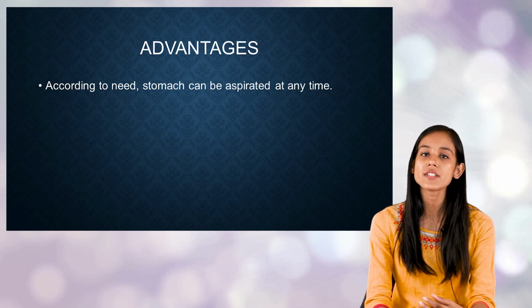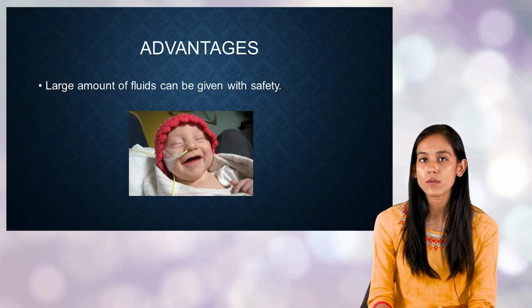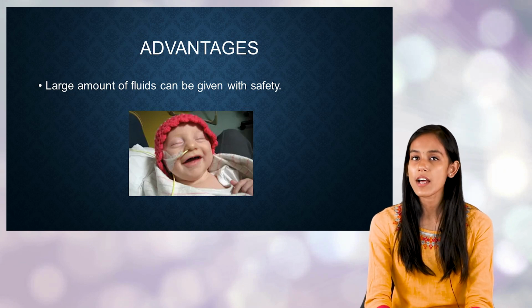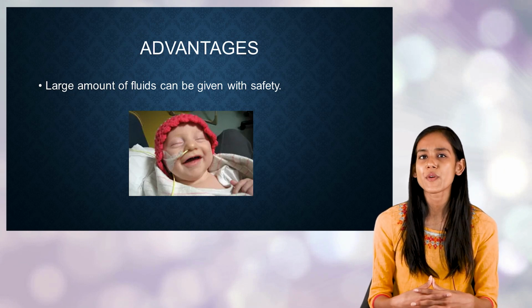So, according to the need, the stomach can be aspirated at any time, and a large amount of fluid or a large amount of food can be given with safety. So, these are some of the advantages of nasogastric tube feeding.